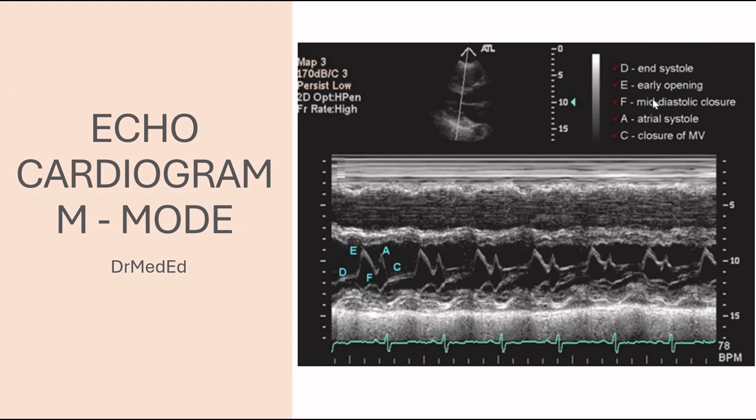D is for end systole, E is for early opening, F is for mid-diastolic closure, and A is for atrial systole when the leaflet is open again, and C stands for closure of the mitral valve. So this is the M-mode through the mitral valve.